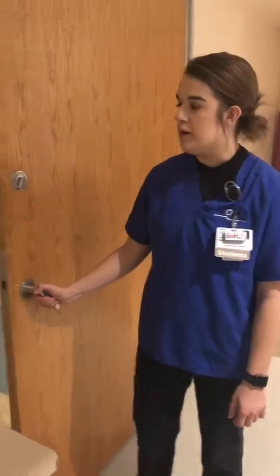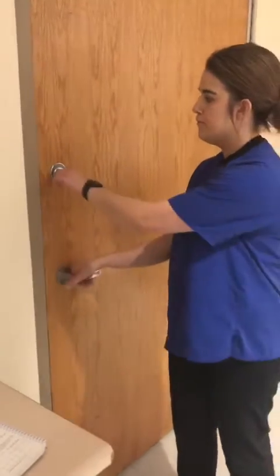For the AP supine abdomen, I'm going to use a large focal spot, and for the PA Caldwell skull, I'm going to use a small focal spot. When I bring the patient in, I'm going to make sure that I close the door, and I'm going to ask them two patient identifiers, which can be name and date of birth.